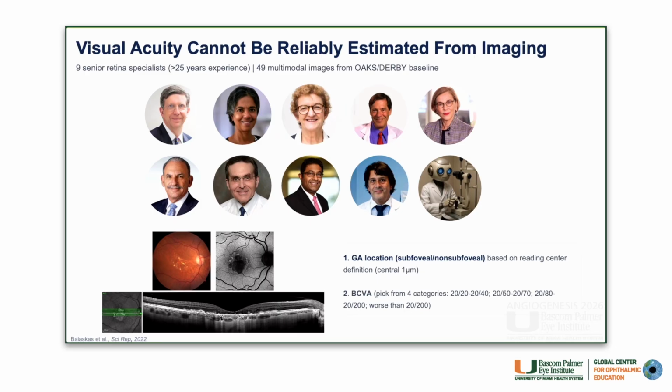Additionally, we wanted to know if AI could estimate visual acuity. To do this, we used an AI trained on the Phase 2 FILLY data by the Moorfields Reading Center for visual acuity estimation.